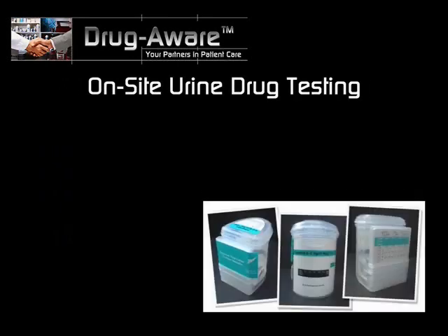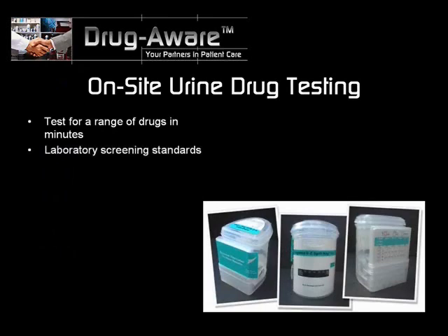On-site urine drug testing kits are a commonplace item in many hospitals, drug treatment and rehabilitation centers, doctors' surgeries, and businesses. They enable you to test a urine sample for a range of drugs in minutes to laboratory screening standards. Negative results can be read in as little as a minute, but positive results typically require 5 minutes before you can be sure of the drug test result.